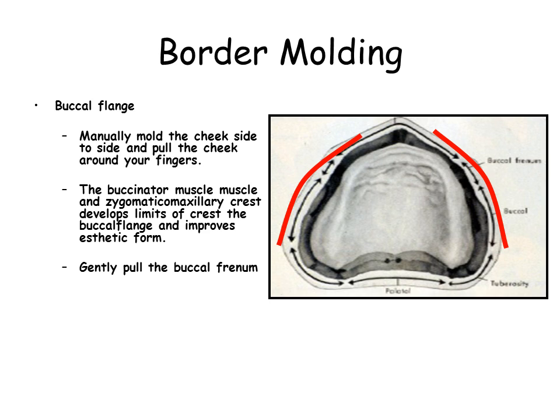The buccal labial vestibule is border molded. Ask the patient to suck down as if using a straw. Gently pull the cheek to register the buccal frenum.